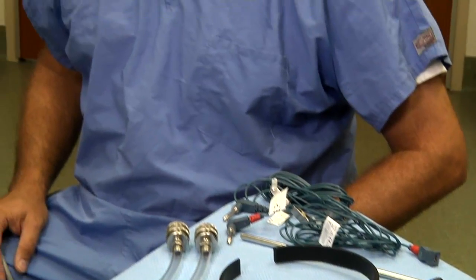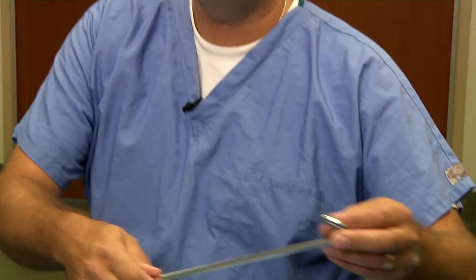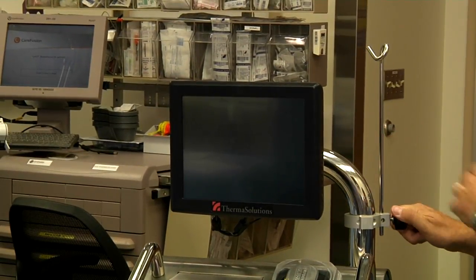Now we're going to prepare the HT2000 and we'll make sure all the hardware components are on the device in case they're not on there when you start the case. The first item is the power cord, which we'll plug into a standard wall outlet. The next component is the IV pole, which hangs on a bracket on the C-arm of the device.